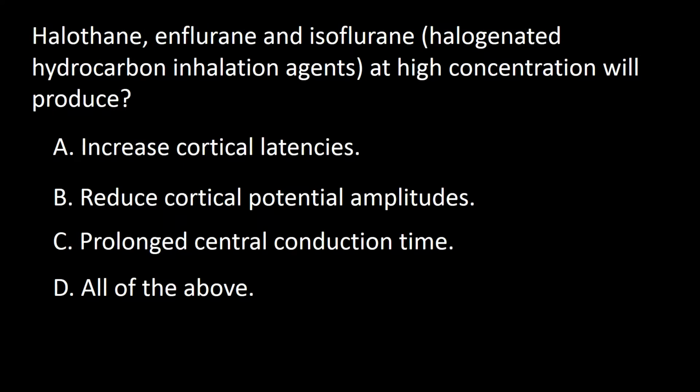Next question. Halothane, enflurane, and isoflurane, which are halogenated hydrocarbon inhalation agents at high concentration, will produce A. Increased cortical latencies, B. Reduced cortical potential amplitudes, C. Prolonged central conduction time, D. All of the above.